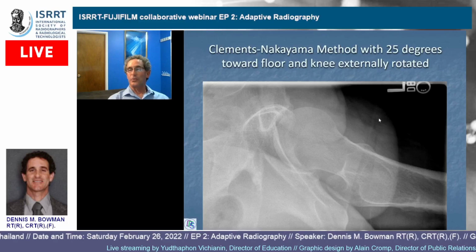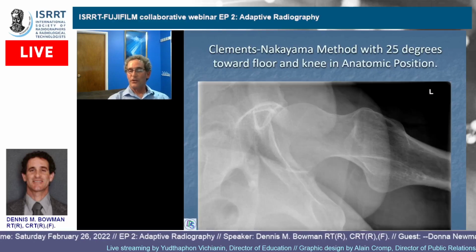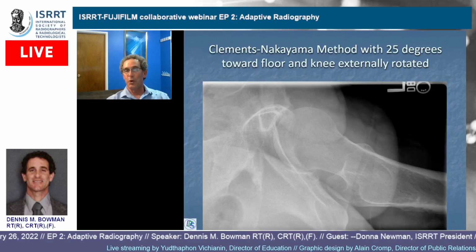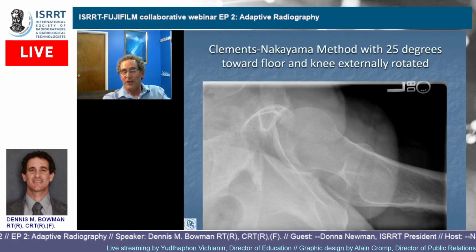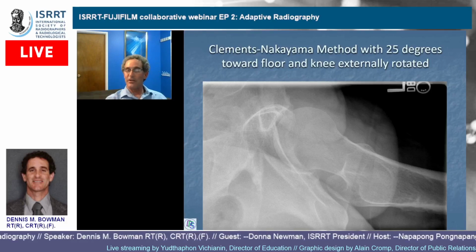And then this is what it looks like when their hip really is flopped out. So it's the difference between that's anatomic, that's not. Again, that's not going to have anything to do with you. That's just them, and they can't move it. It's obviously a potentially fractured hip. So you're certainly not having them move that leg at all.